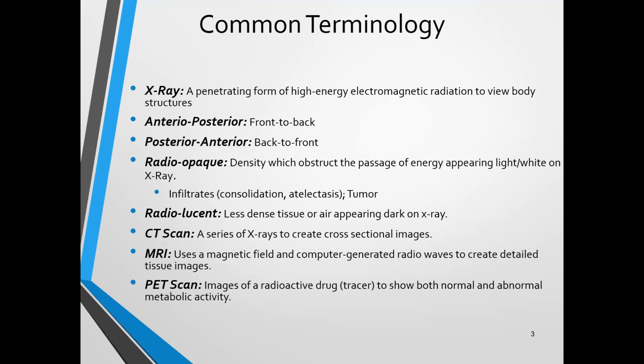So the CAT scan is actually a series of slices, or a series of X-rays, to create cross-sectional images. One of the big advantages of a CAT scan over an X-ray is it can give you the 3D, the depth. By definition, it's giving you depth. For instance, a single X-ray is not telling you the depth potentially of, let's say, a tumor. Some tumors are round or roughly round. Some are not at all. Some are much more deep than they are, if you will, high and wide. They can really vary. So the CAT scan is giving you that depth.